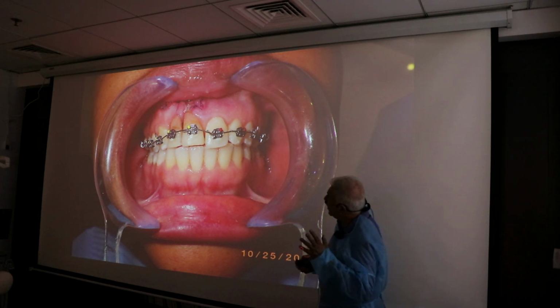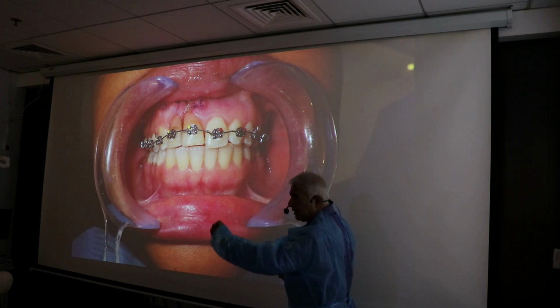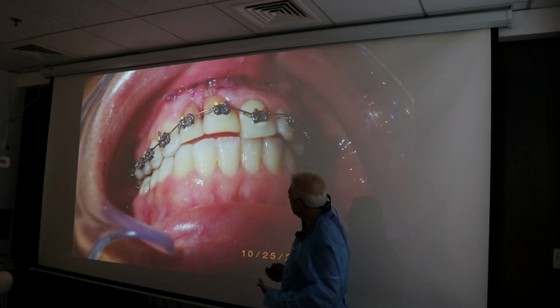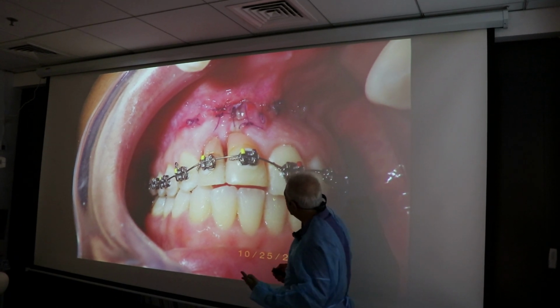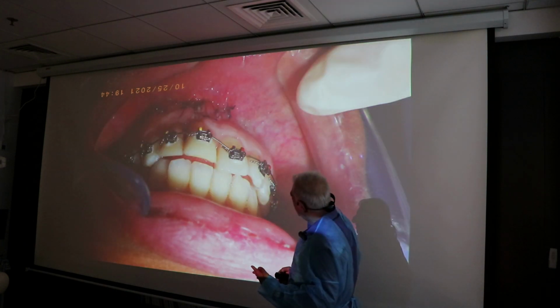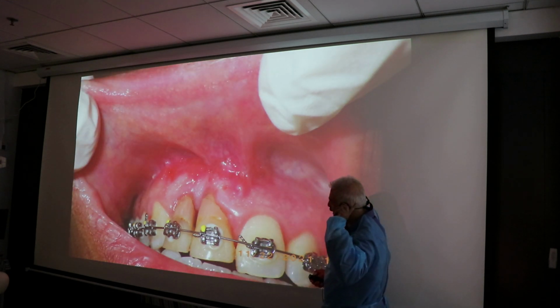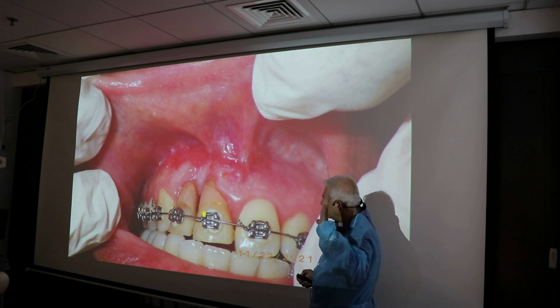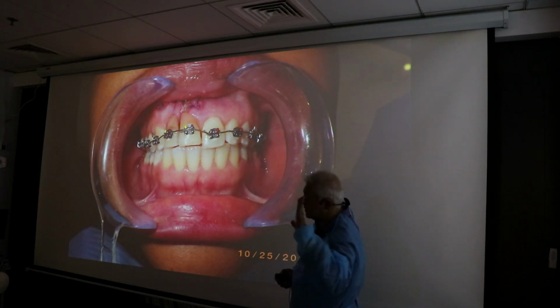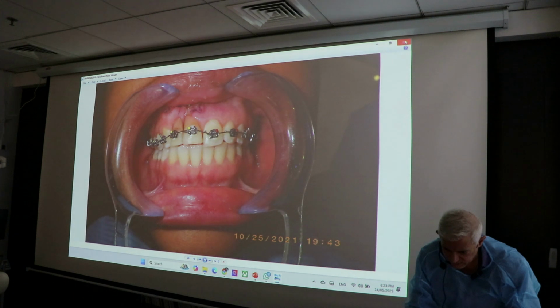Now you might say, was that soft tissue necessary? I will ask you to answer that question by just looking at the sequence of the photographs. Look at the scenario now. As we proceed further, you can slowly appreciate what happens with this tissue as the tooth is erupting downward or being pulled downward. What happens to that thick soft tissue? Can you see what I see or not yet? Yes, and it is coming downward, where the future area that you actually want the soft tissue to be.